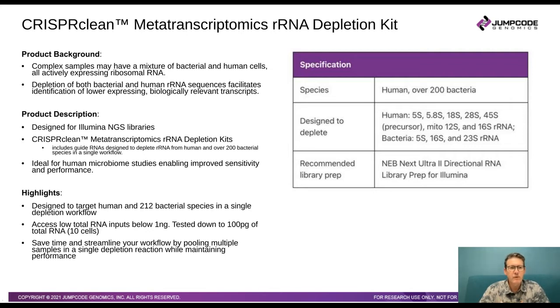When we use the CRISPR-Clean technology to deplete and effectively eliminate the bacterial and human ribosomal RNA from these samples, we essentially facilitate the identification of lower expressed transcripts and biologically relevant transcripts.